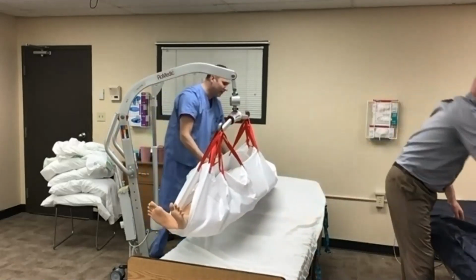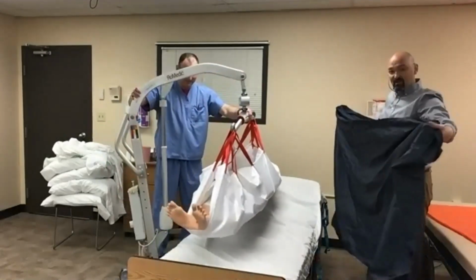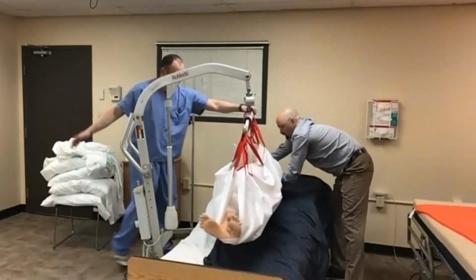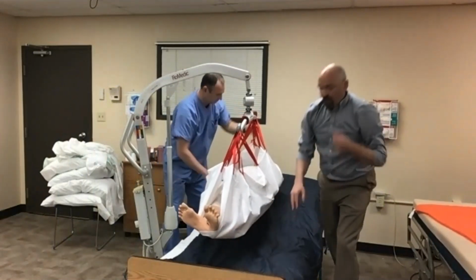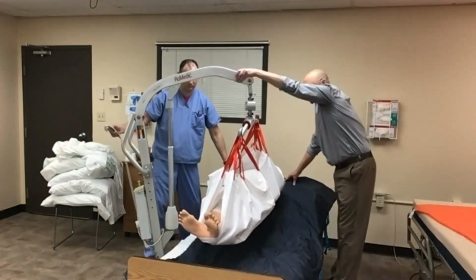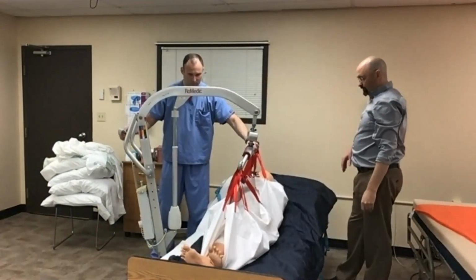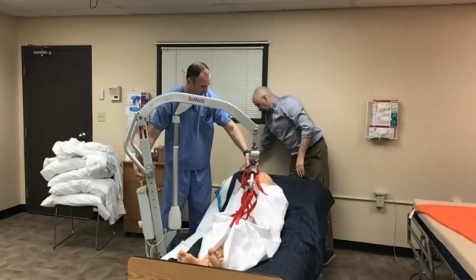Obviously, we would have more people so our patient wouldn't be dangling like a sack of potato. The second thing we're going to do is, between the two surfaces, apply a slide sheet about three-quarters of the way underneath. The reason is when we go to turn that patient, that's going to keep that bottom repositioning sheet in place. Perfect. It also makes it easier to get that last little bit of proning.